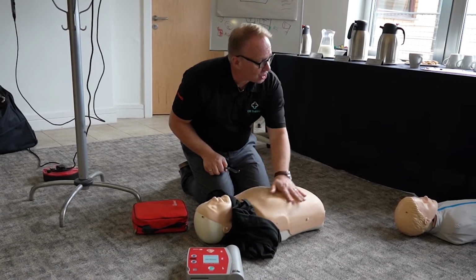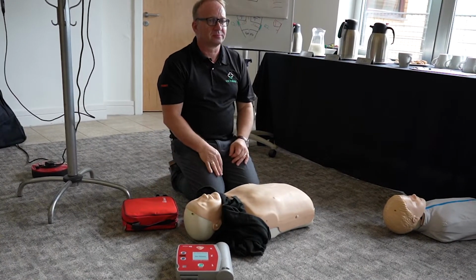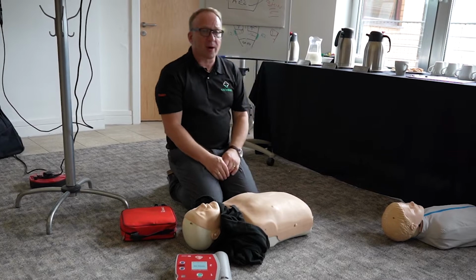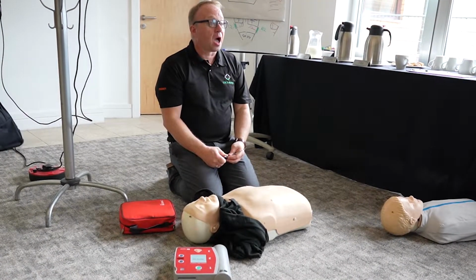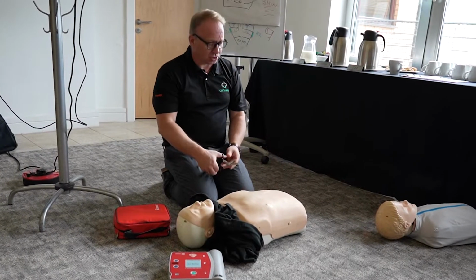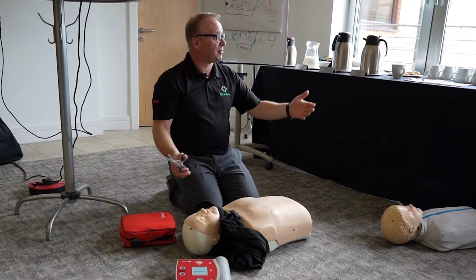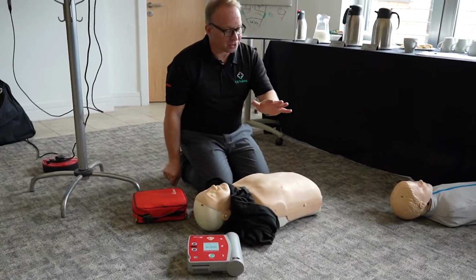Then we're looking for other considerations on here. What we're looking for. What if you've got a bra on? Does it have to come off? Yeah, there might be wire in it. It does. Snip it off, pull it down, whatever you have to do, but it has to come off. There's no two ways about it. Anything else?